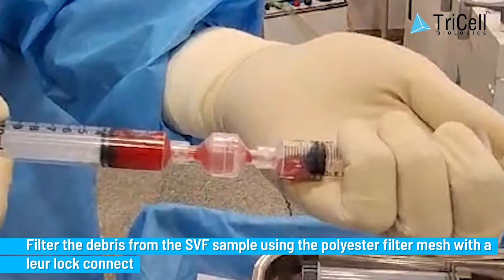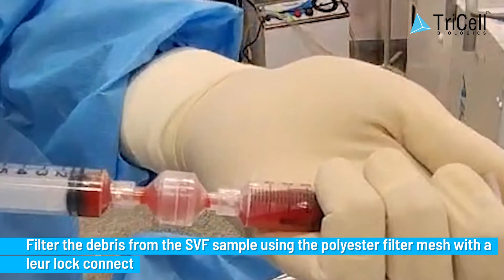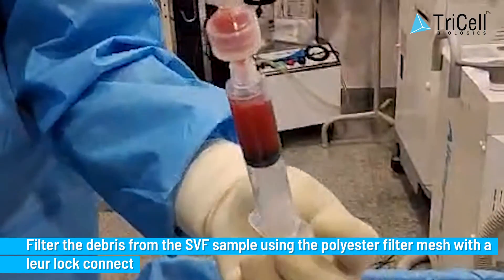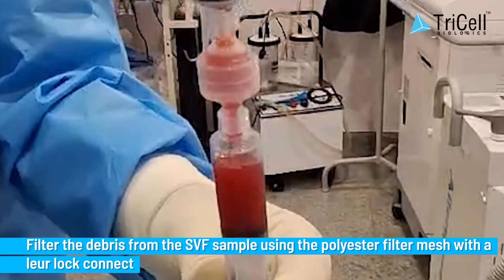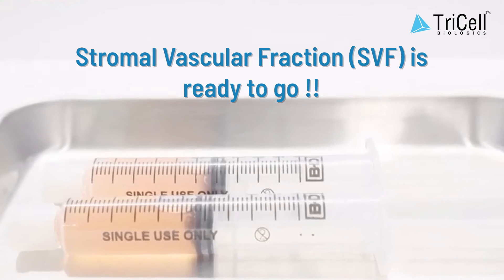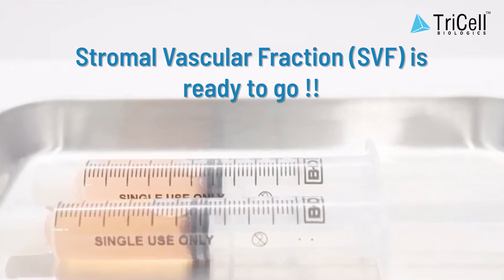Step 12: Filter the debris from the SVF sample using the polyester filter mesh with a Lure Lock connector. Stromal vascular fraction is ready to go.